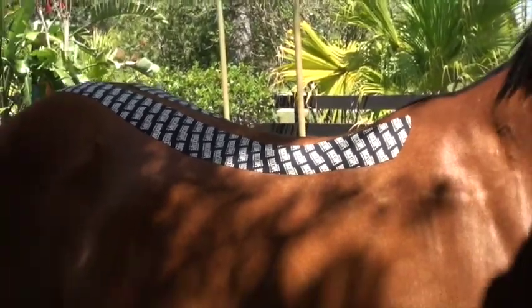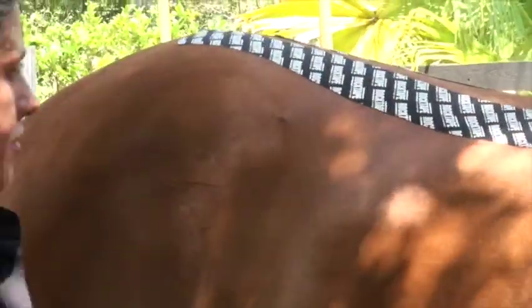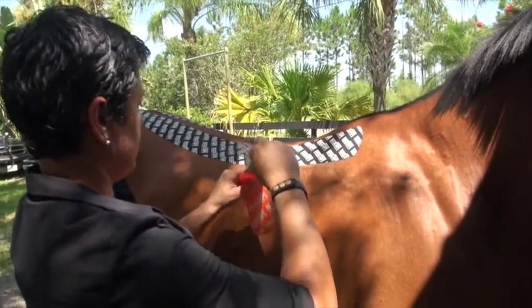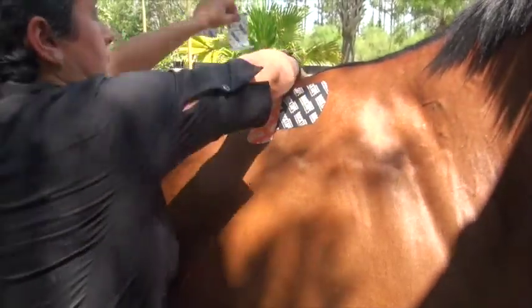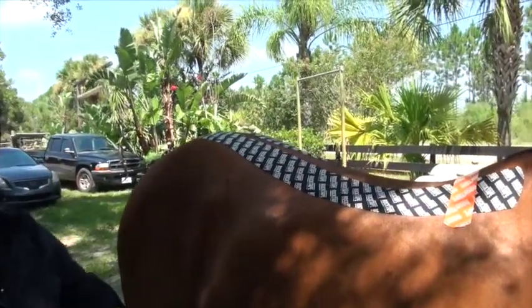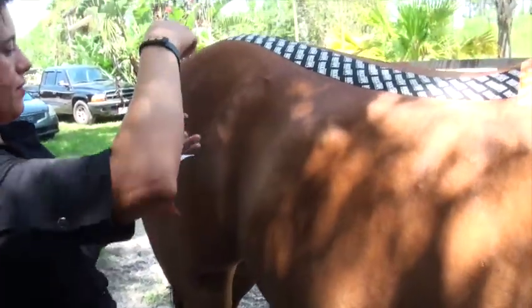Then I'm going to cut 2 support pieces. And for this, I'm going to use the 2-inch rock tape. This is half the width of the 4-inch. And we're going to place 1 support piece up along the withers. Like that. Along the bottom of the tape. Just like that.